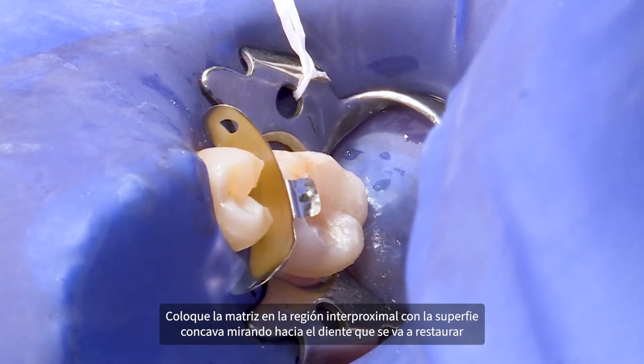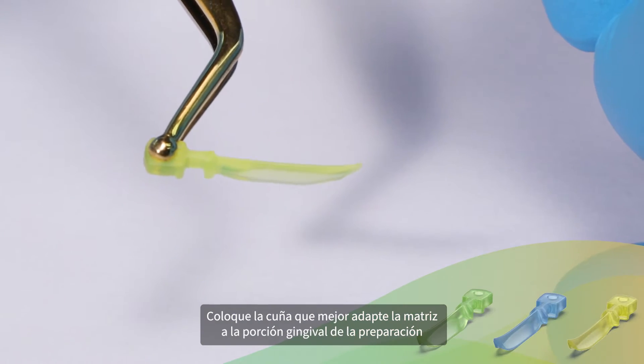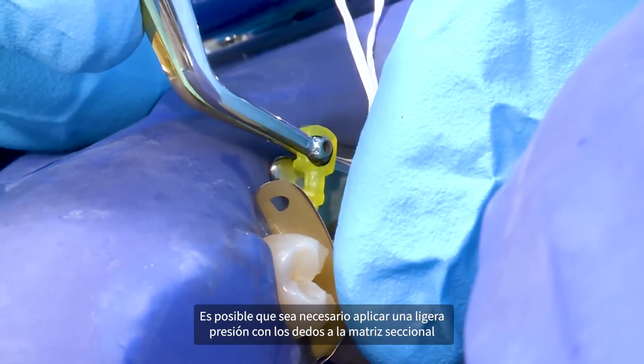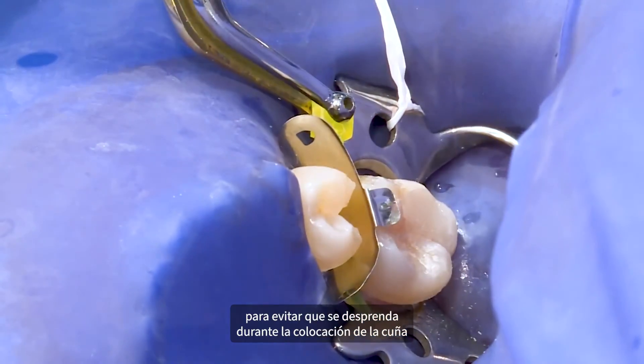Place in the interproximal region with the concave surface facing the tooth being restored. Place the wedge that best adapts the matrix to the gingival portion of the preparation. Light finger pressure may need to be applied to the sectional matrix to prevent it from being dislodged during wedge placement.